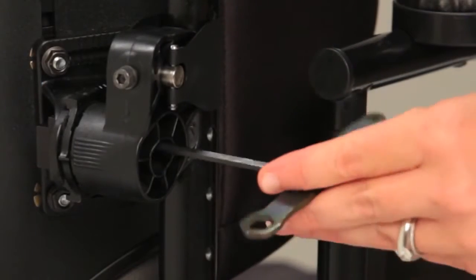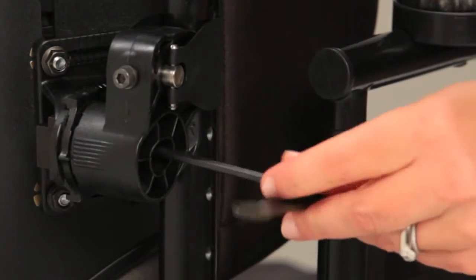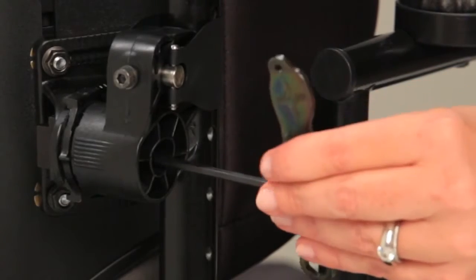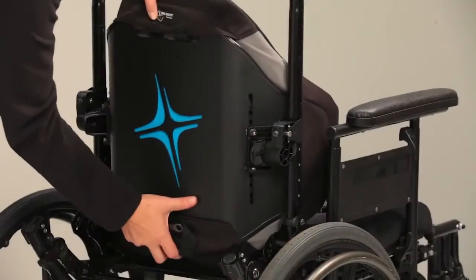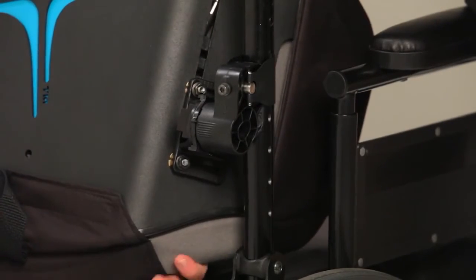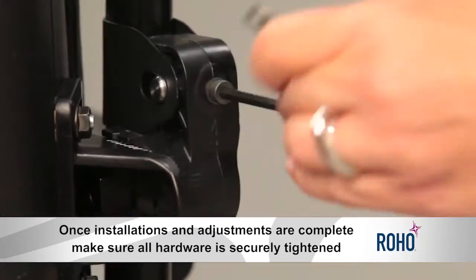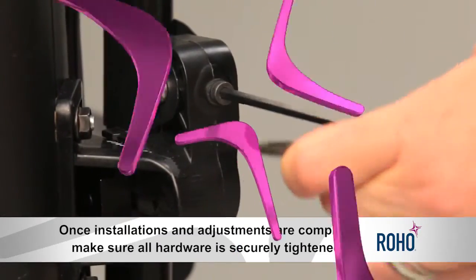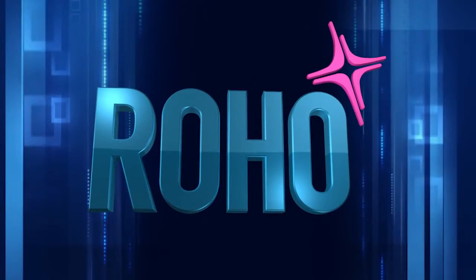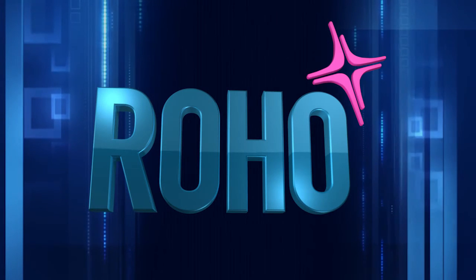Once depth and angle adjustments have been made, tighten right and left depth and angle adjustment bolts with the Allen wrench until snug, plus a quarter turn. This completes your height, depth, and angle adjustments for the Agility fixed hardware. Once installation and adjustments are complete, make sure all hardware is securely tightened. ROHO Agility Back Systems are the perfect blend of innovative features, giving wheelchair users comfortable support without sacrificing function.